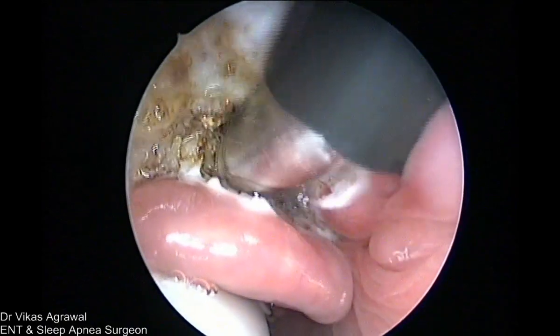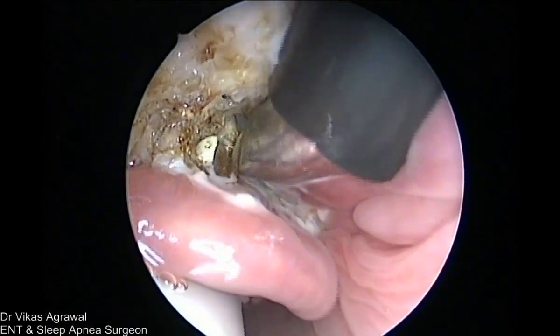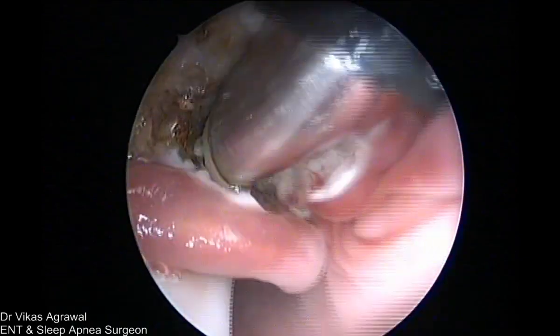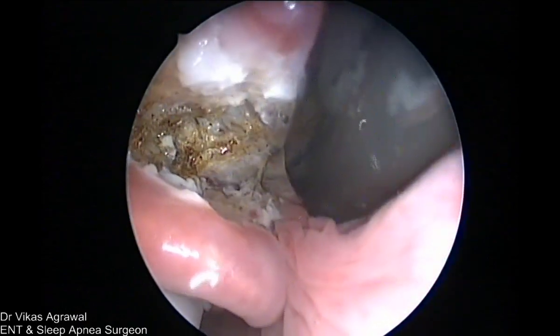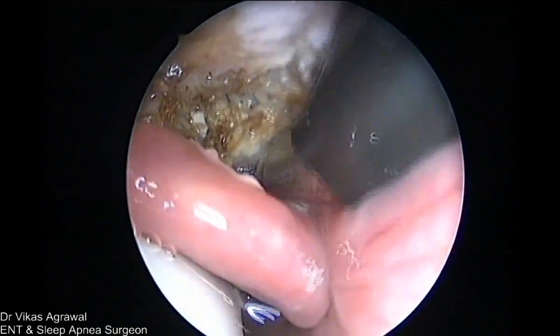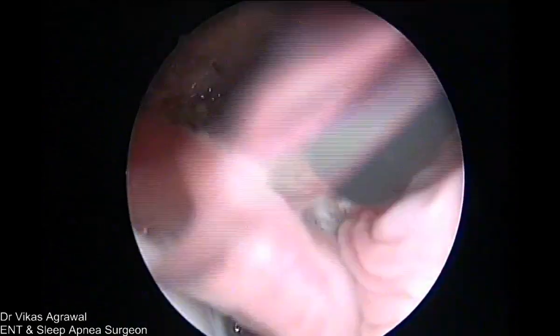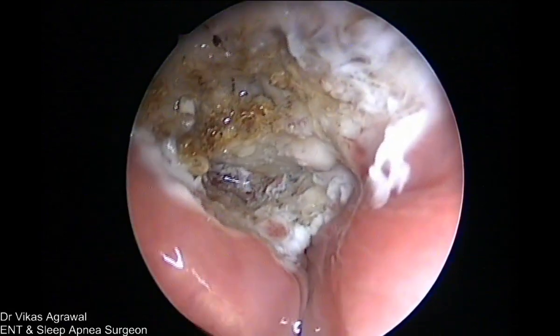Right, so this is in midline. Now here I have to reach the median glossoepiglottic ligament. Can you see that?